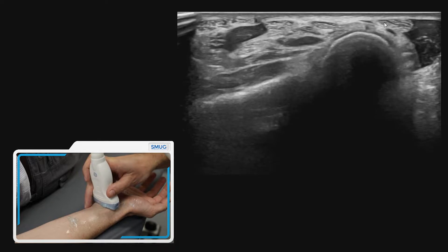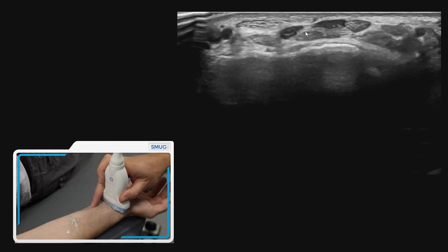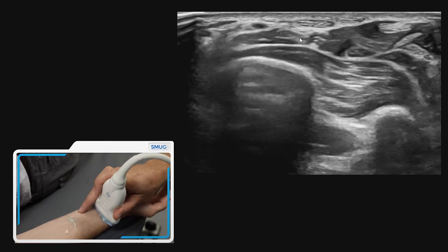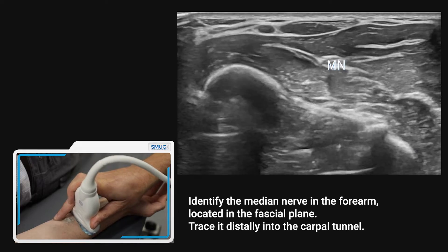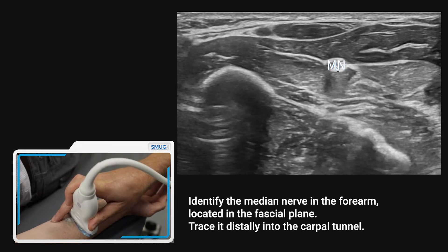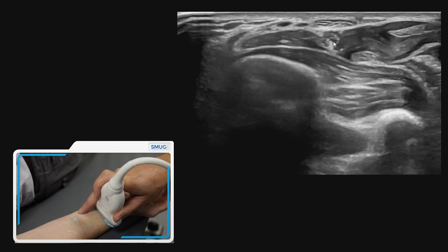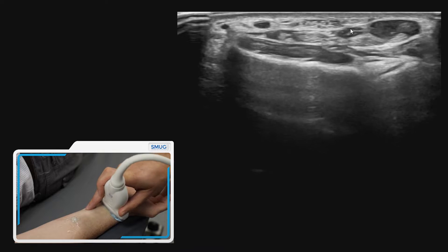If we move back up proximally and more centrally, we can start to pick up the median nerve. Moving more proximally, the median nerve is the structure that will find its way dropping deeper into the forearm, and we can follow it up and onto the pronator quadratus that we saw earlier.